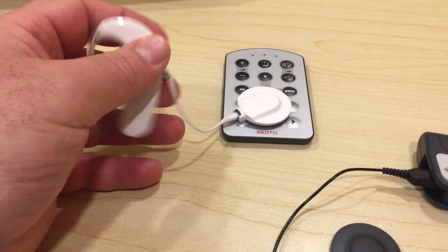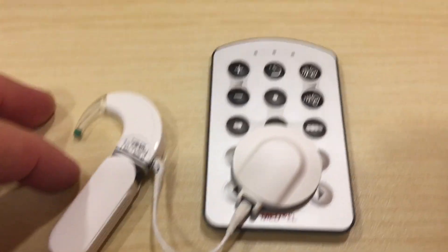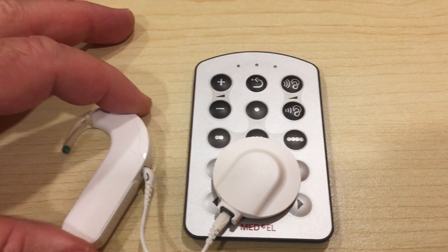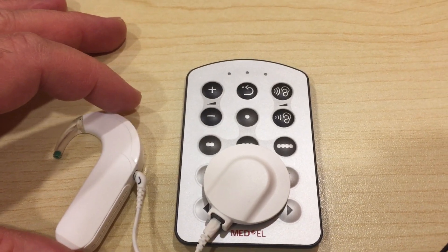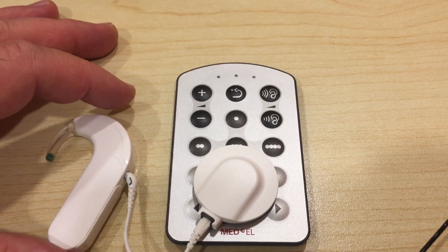Remove the battery cover. Now watch as I put the battery cover back on. There are two lights that indicate that the processor is paired with the fine tuner.